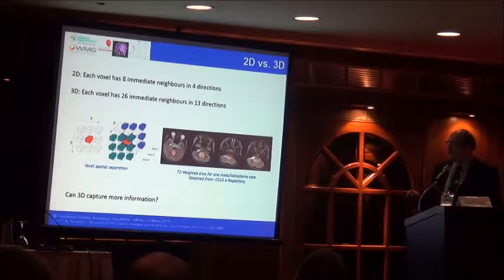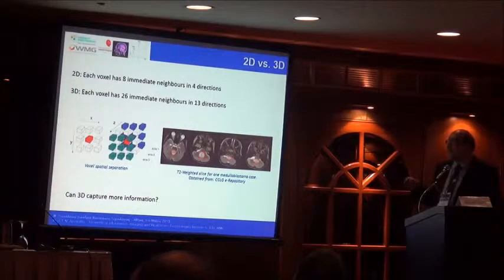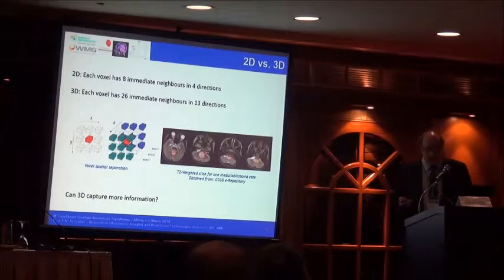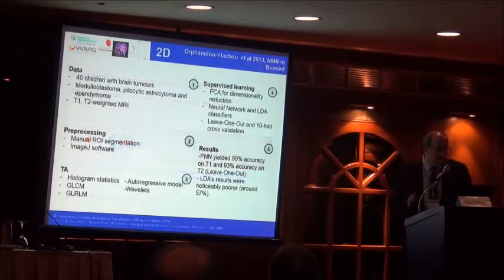So what we are doing is we look at 2D representations. Again, a voxel there might have 8 neighbors in all four directions, or 3D, which might give us a little bit more information about the neighborhood. And one of the things we have been studying most recently in the past years is that 3D capture is a better way to discriminate for diagnosis and prognosis. So I will give you some examples of how some of our work has happened and what we have achieved until now in the 2D space and the 3D space.